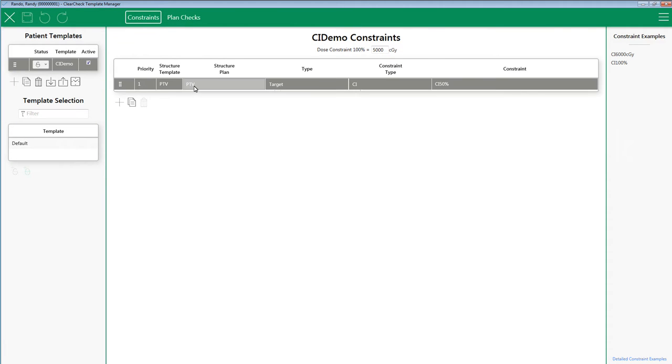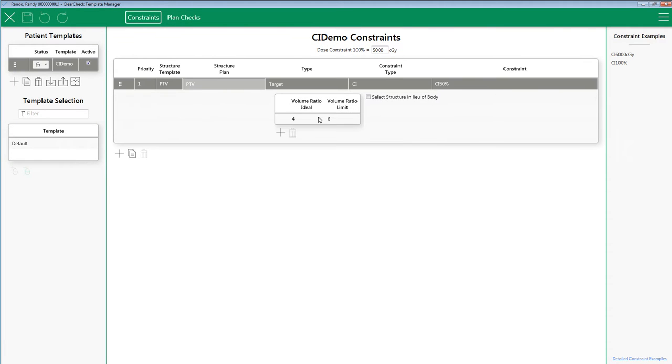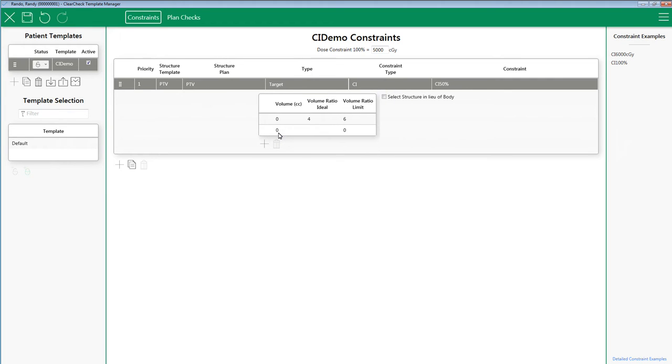Let's look at this now, and how this table works. Currently the table is set up with only one row, and is not using the target volume column. As soon as I hit the Add icon here, we can start building the table. Now you will see a new column is added for input, volume CC. Let's build our table.